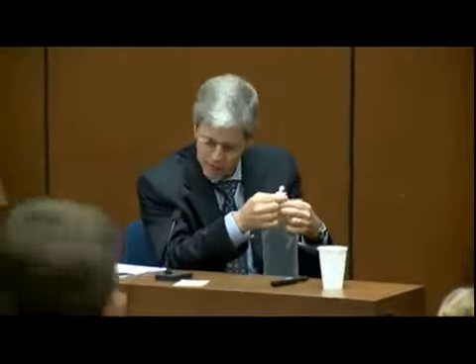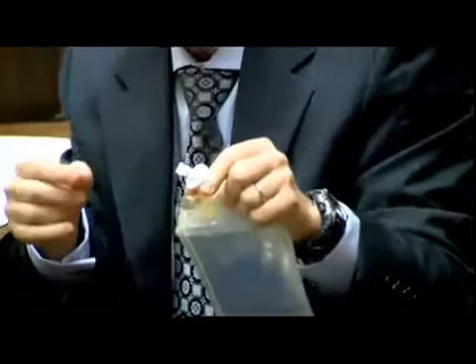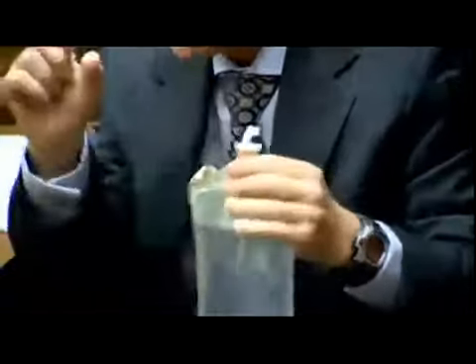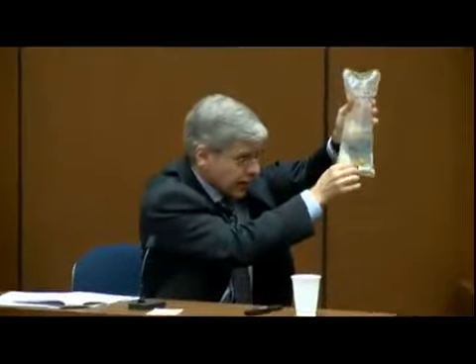This right here is where you take something called a spike. It's a big white, thick plastic needle. And you put it in here, and it allows a way of getting the liquid, the saline, out of the bag, through the tubing, and into the patient.